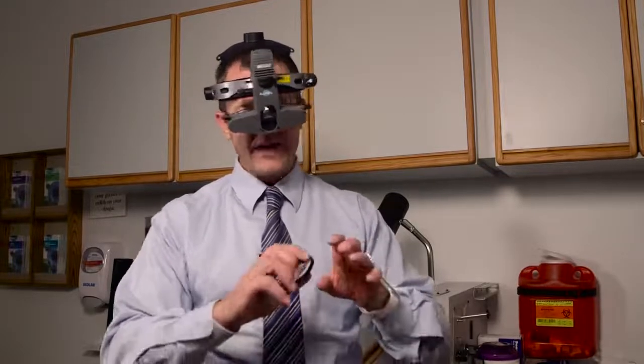By doing the same exam every single time, when I note a change at 9 o'clock, or 2 o'clock, or 4 o'clock, by doing the exact same rotation hundreds of times over, I don't have to think twice about where I saw a particular change. So when I write it down on my exam, or type it into my EMR, or put it onto my drawing, it helps me to remember where I saw the changes. I personally think that's a critical step in doing the ophthalmic posterior segment far peripheral exam.